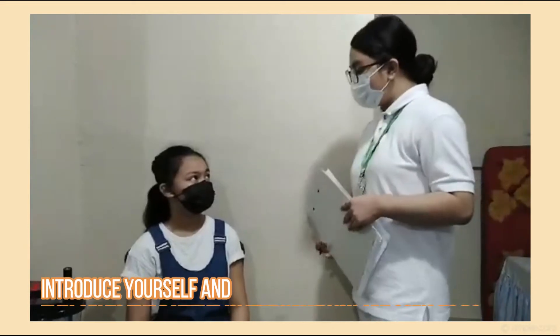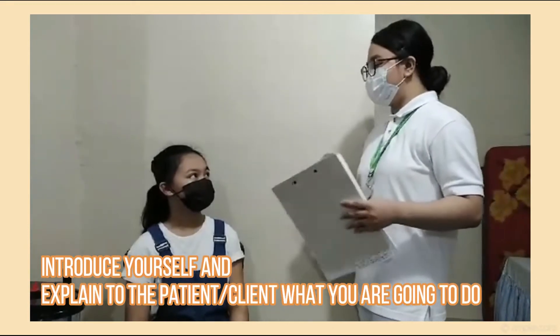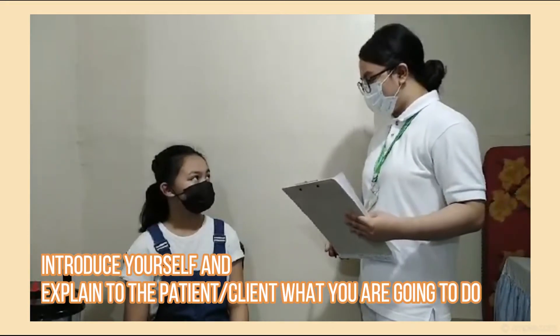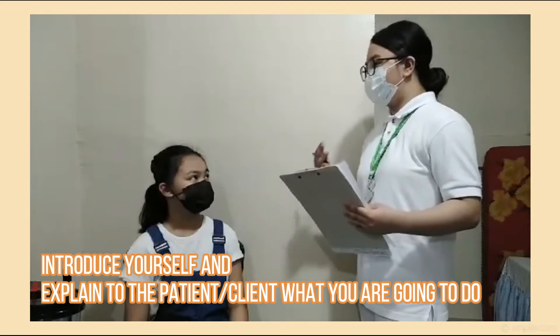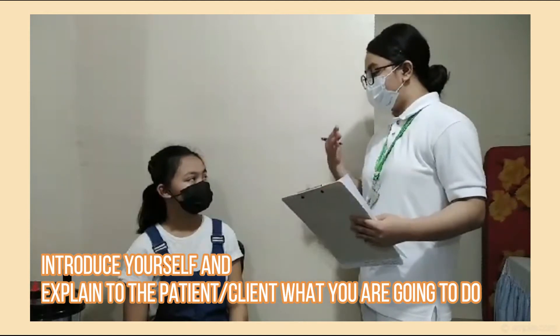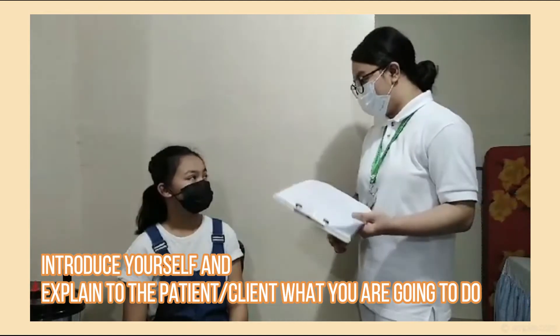Good day, Ms. Al Rafa. Good day. I'm Marjorie, I'm a student nurse here, and I'll be assessing your eye structure and visual acuity. Is that alright? Yes.